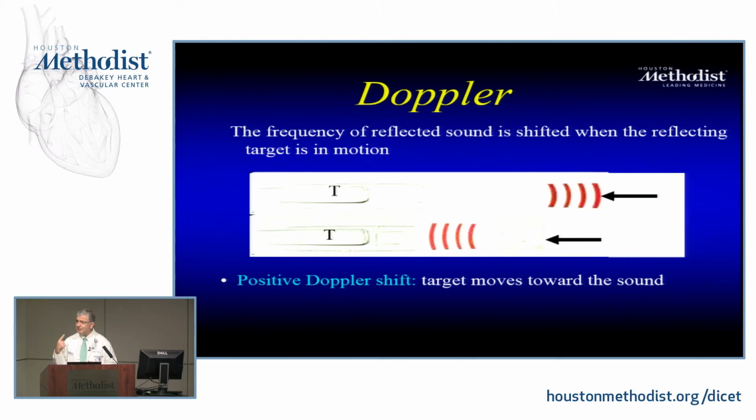So that frequency shift is occurring in the audible range. And the beauty of this equation is, if this moving object is going, I can tell 2 things, at least, from this shift. I can tell the direction, if an object is coming toward me or going away from me, okay? And I can tell conceivably also the speed. So I can get direction as well as speed.